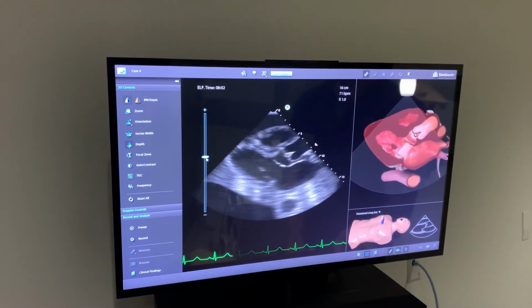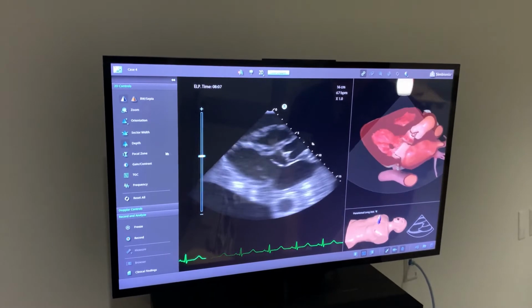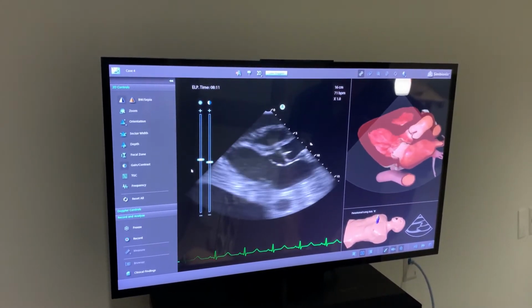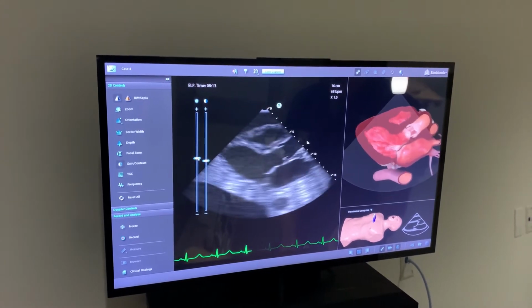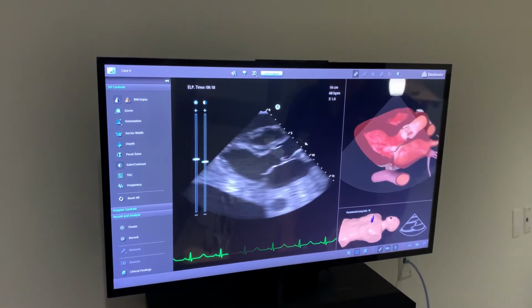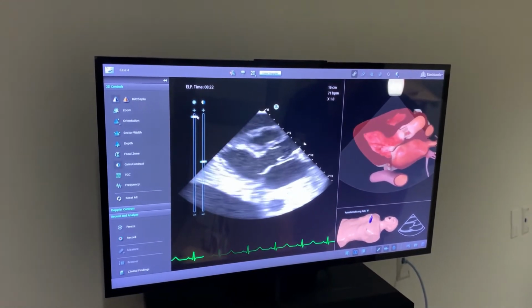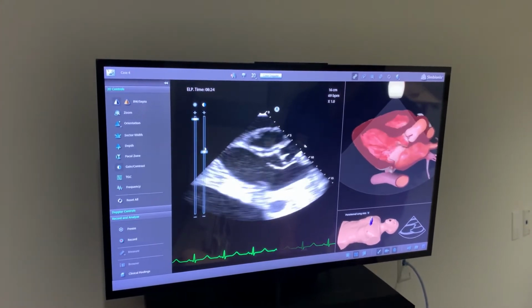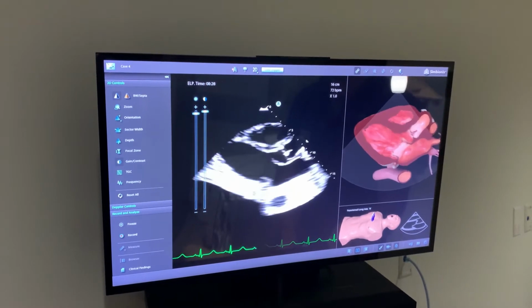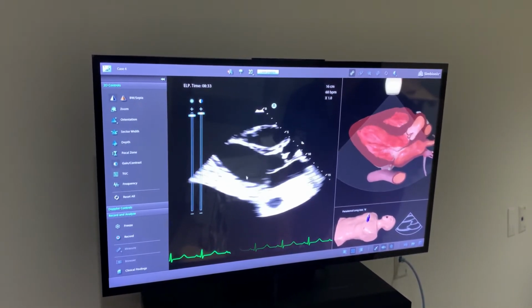When you have the actual ultrasound machines, it's just a knob that we'll show you on a separate video. And then the other thing to keep in mind is your gain or your contrast. What you want to do here is optimize it so that you can actually see the structures of interest best. So you can adjust, this is the gain, and this is the contrast. If you have it way up like this, it's almost too bright. There's too much contrast and too much gain, so it's almost distracting from what you're actually looking at.